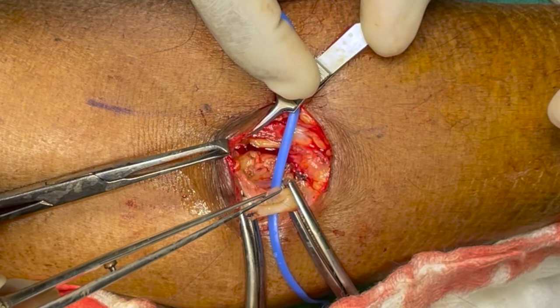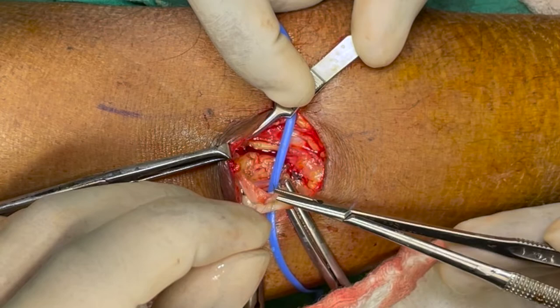Here I am using a loupe with 4x magnification, and what you are watching is recorded with an external camera.